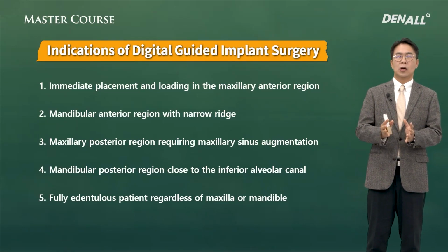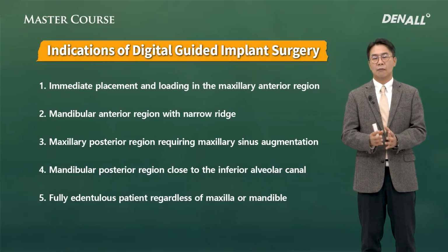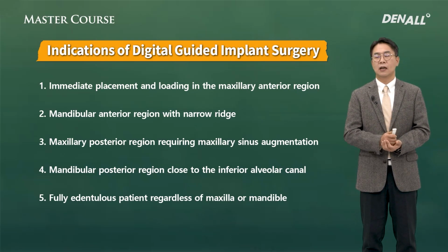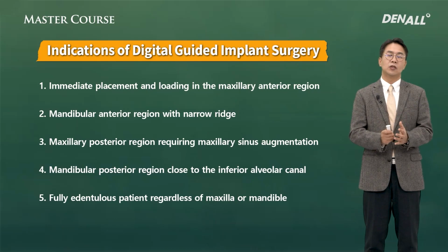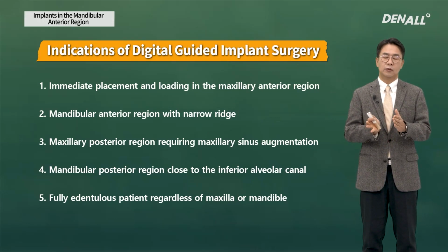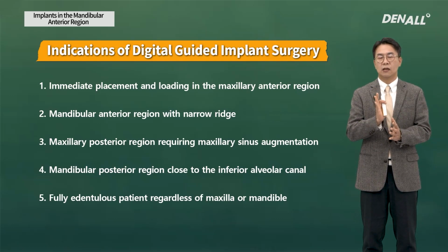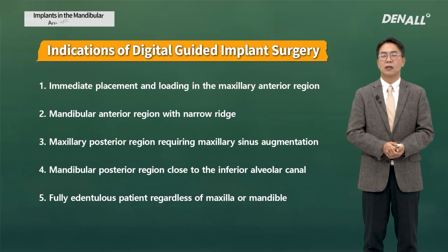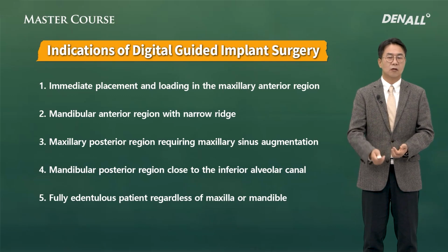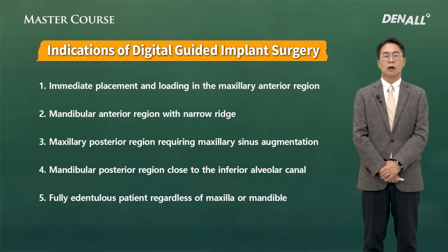There are many areas where guided surgery can be applied. Among them, I believe you can use it often in the mandibular anterior region because of the characteristics of mandibular anterior, as I mentioned before. The narrow bone ridge, concavity, and inclination of teeth, all these need to be considered. If you are not skilled, you can easily make mistakes, and so you can benefit from it.